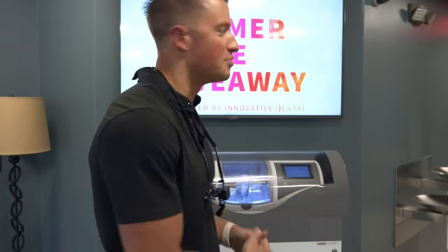You can't just mill out crowns and go, yay, I've got it all done. Almost every restoration we have that's going to be visible in the cosmetic zone especially is going to get some final touches placed on it. If you go back and watch our live treatment, we do all of those things. We do custom little glazing and staining. We can give the tooth some liveliness that makes it look very authentic and real.